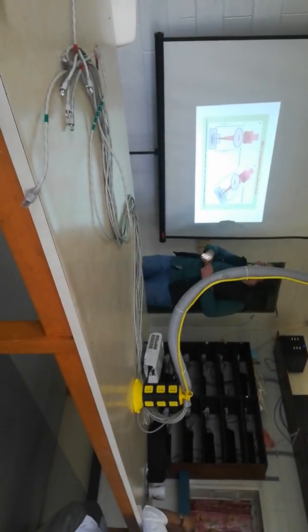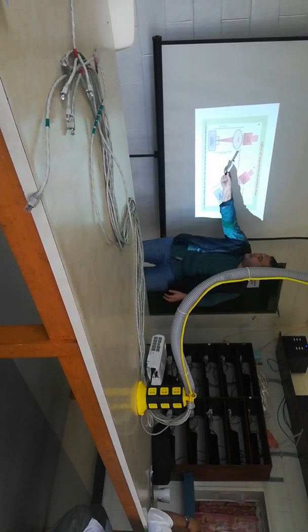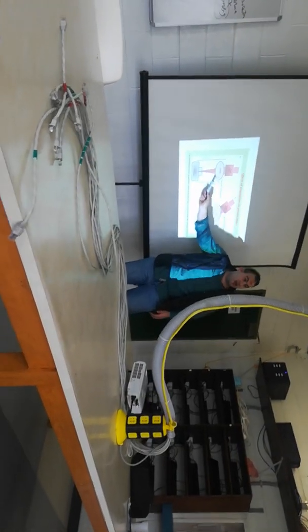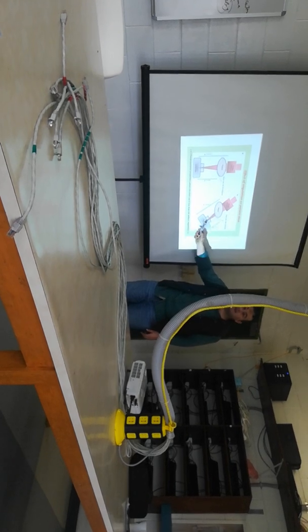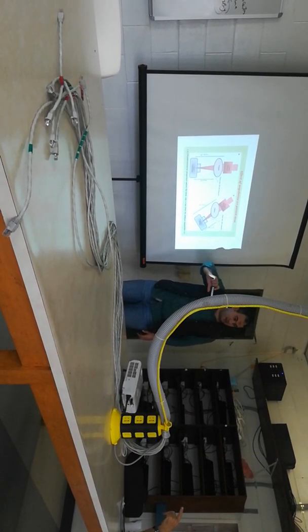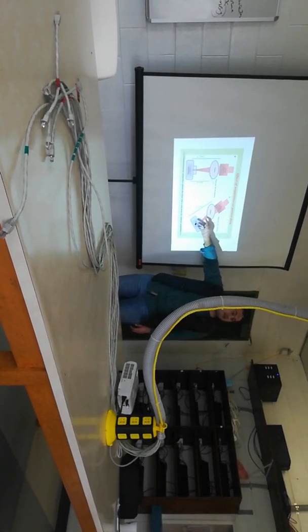of higher thickness. So when you angulate the X-ray tube, what will happen? The distance here from the X-ray tube to the patient is around 8 centimeters. When you angulate the tube, this distance is decreased, and the absorption is increased because the distance is decreased.